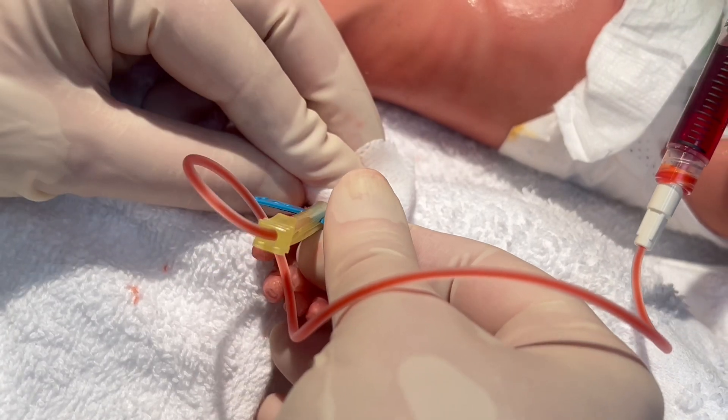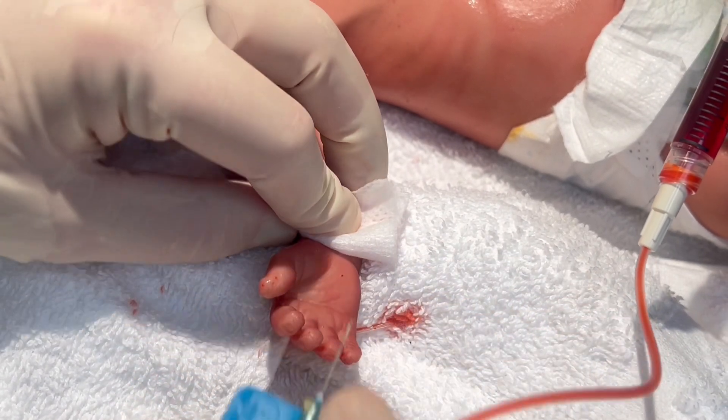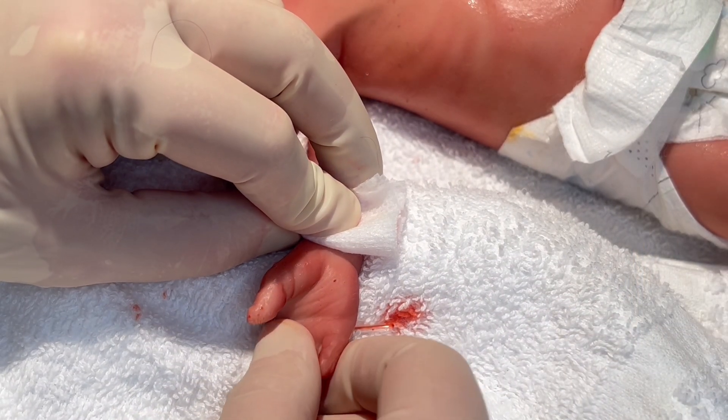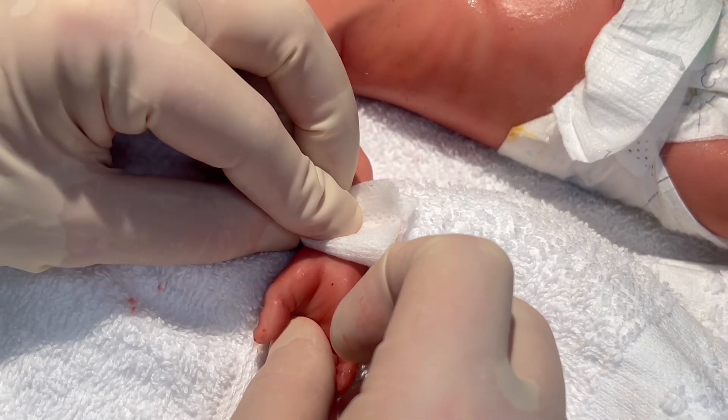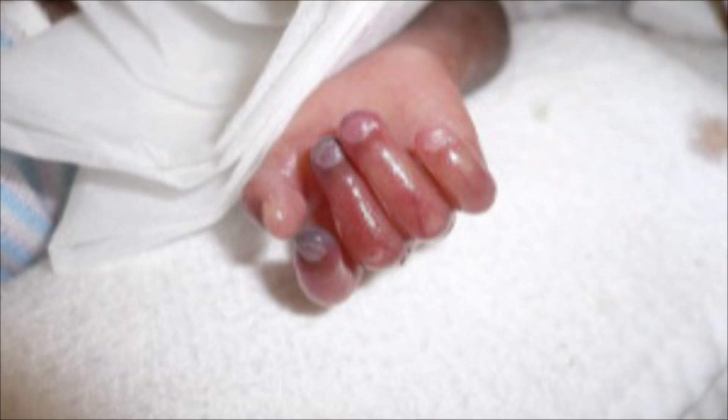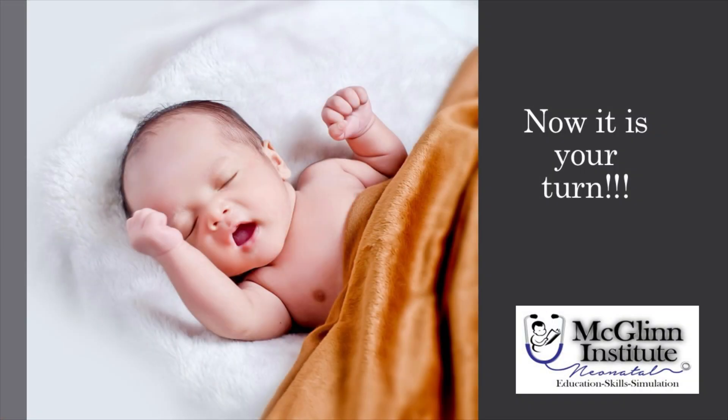Using your 2x2 gauze, cover the site, remove the needle from the skin, and hold pressure. Apply firm local pressure for 1 to 3 minutes to achieve complete hemostasis, and inspect fingers for circulatory compromise.